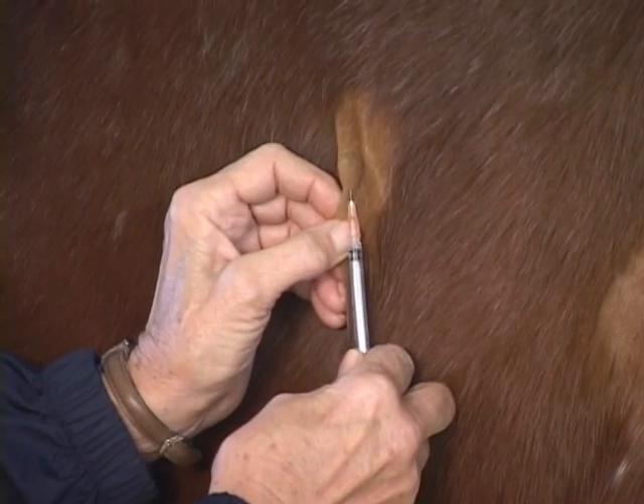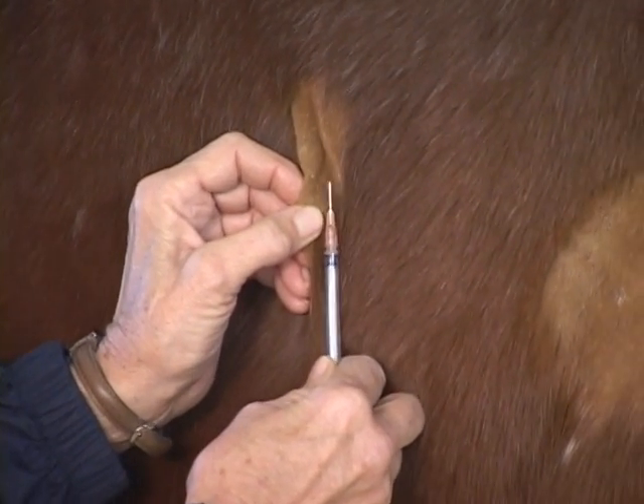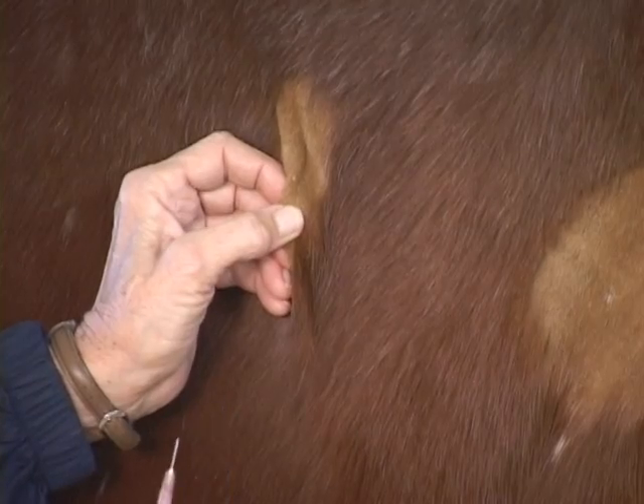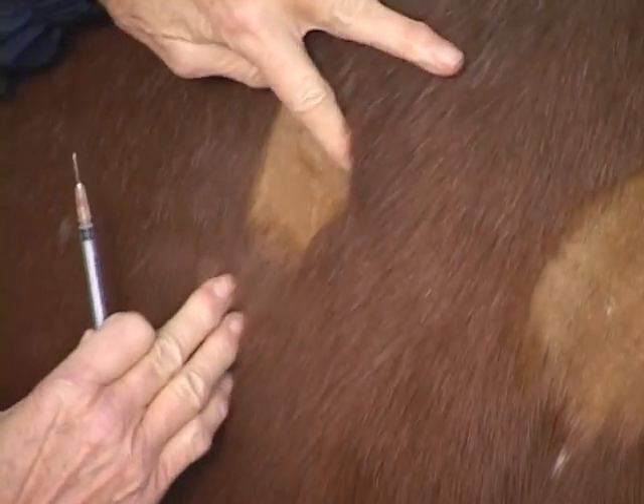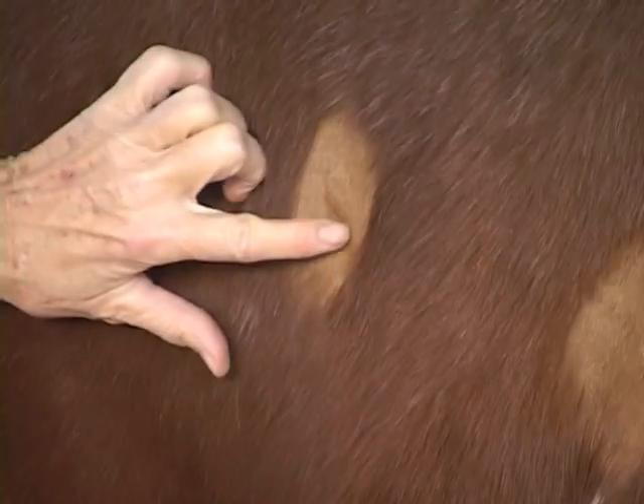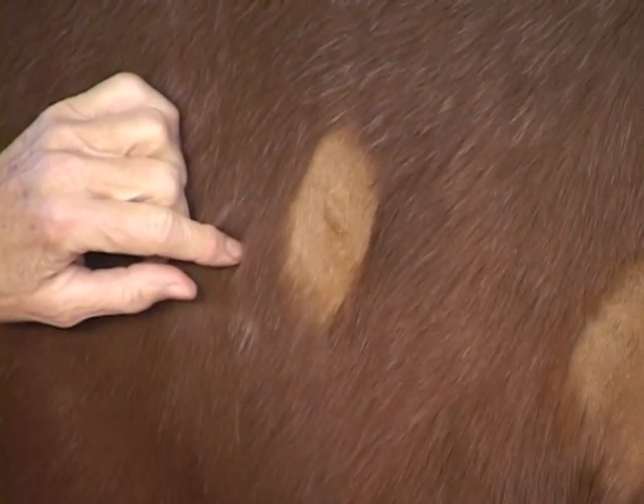Intradermal injections are a little bit painful. They're not terribly painful, but if you've ever had skin testing done for allergies, you'll know that you feel it when they put that intradermal injection in. So you can see we've got a nice bleb there, and that's what you expect to see.